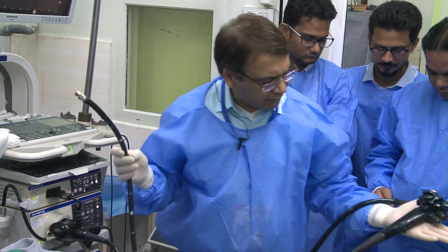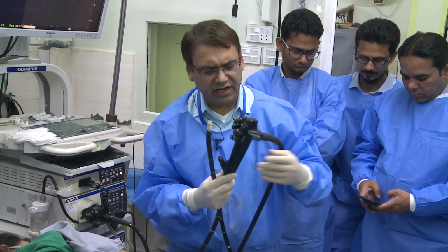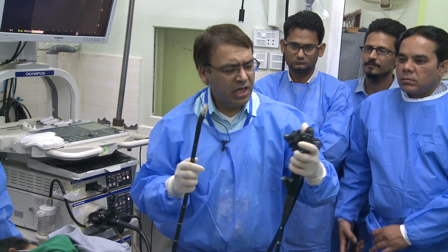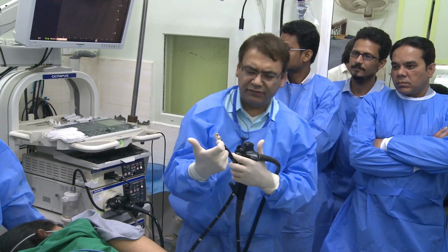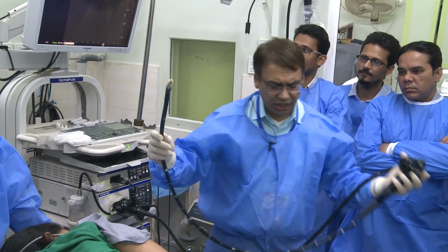So if you look at the scope, this is obviously the handle of the scope. You see the universal cord or umbilical cord. When your scope is in a neutral position and is sitting on a table, the transducer and the cord are in opposite direction to each other.